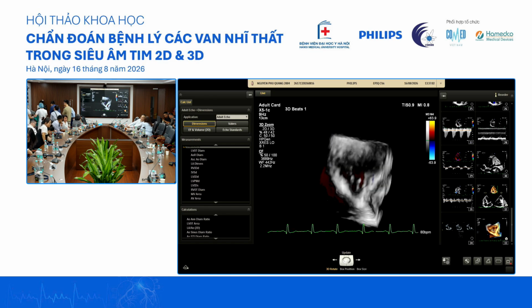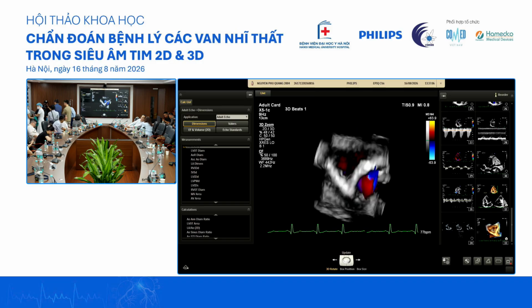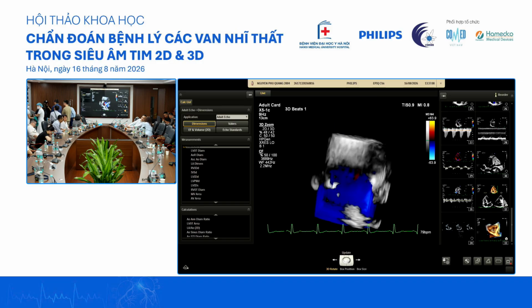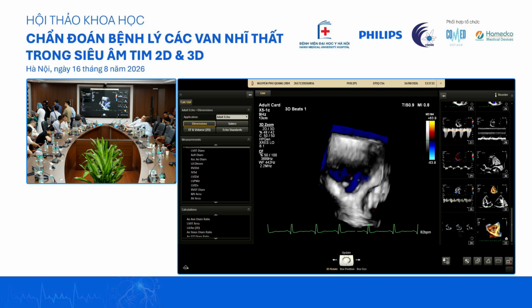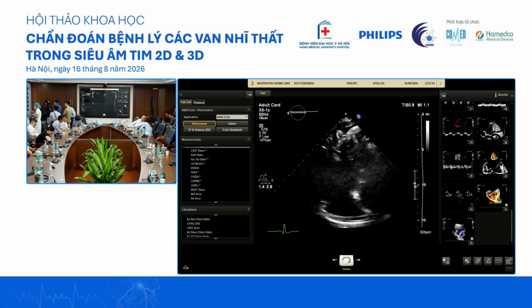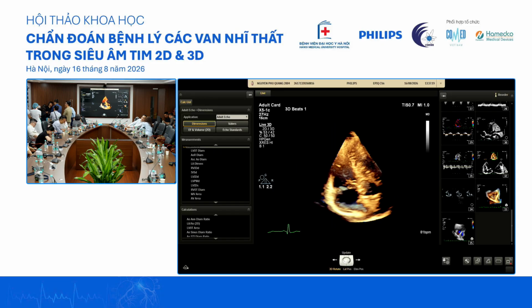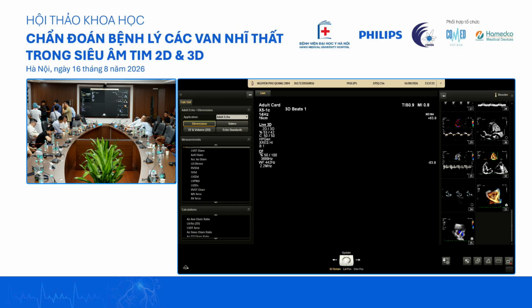Cannot really see. We only catch the tail, you're not capturing. Okay, no worry. You capture this, then you come out. Go back, and turn on your live 3D. Turn on your color.